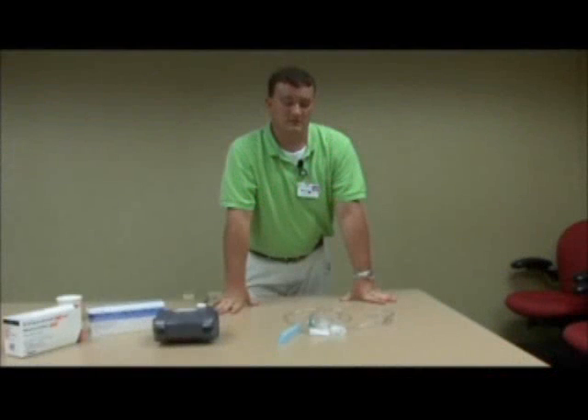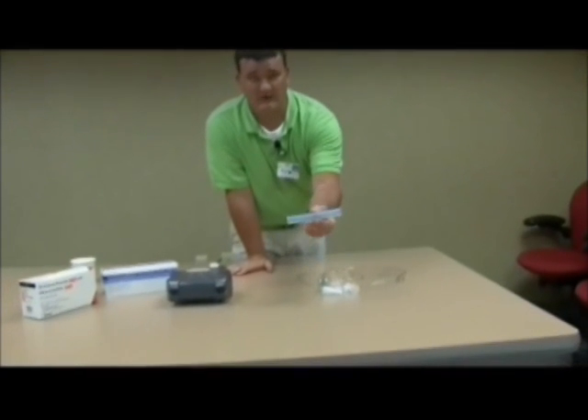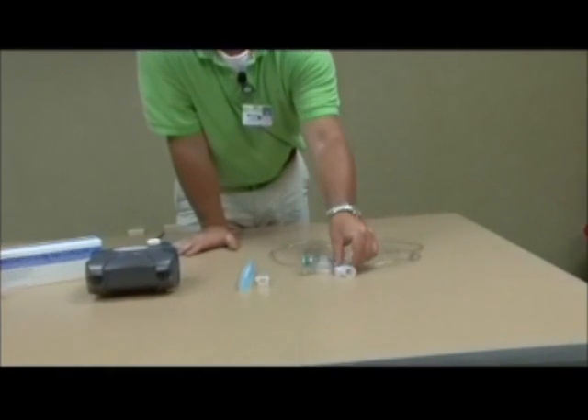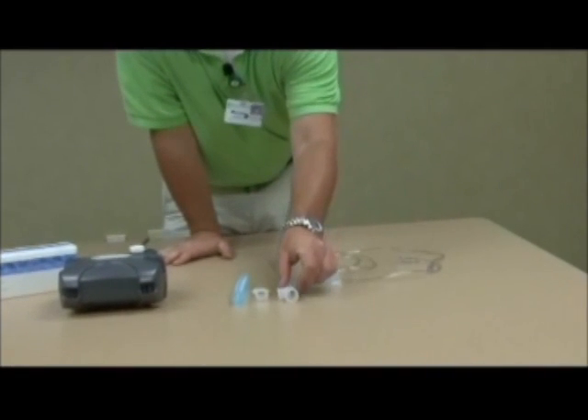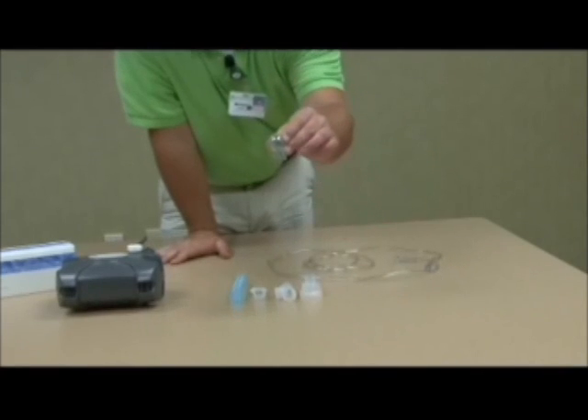Step one, let's talk about your nebulizer kit and what it consists of. You have a pipe, mouthpiece, a tea piece, medicine lid, and a medicine cup with a baffle.